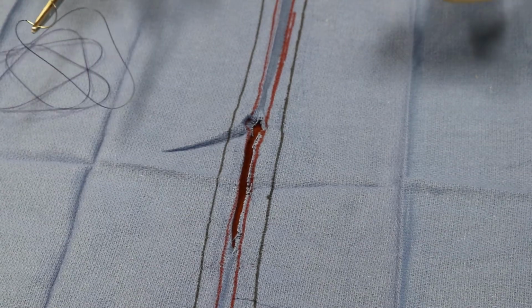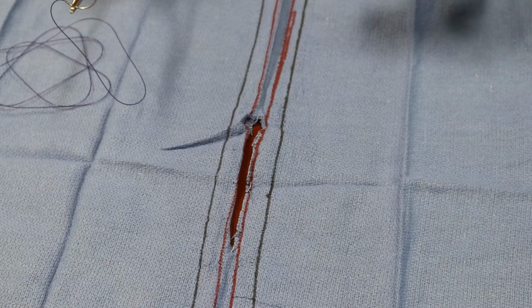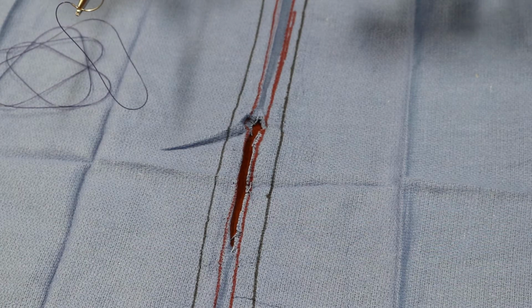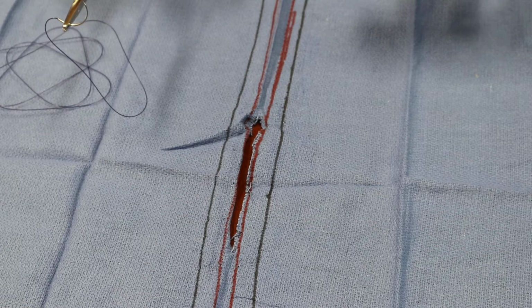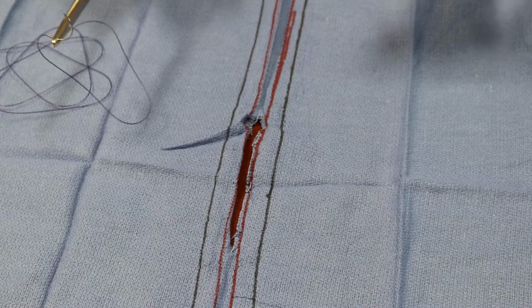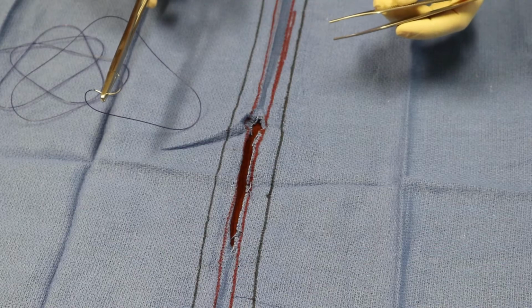Okay, so now we're going to do a Cushing or Connell suture pattern. Remember the difference between the Cushing and Connell is the Connell is full thickness. It's going to go into the lumen. The Cushing is superficial. Does not go full thickness bite. But we're going to start them the same way as the Lembert. That way you only have to learn one way to bury a knot.